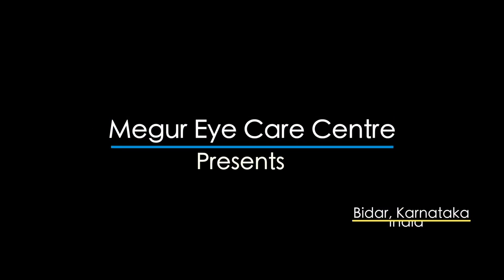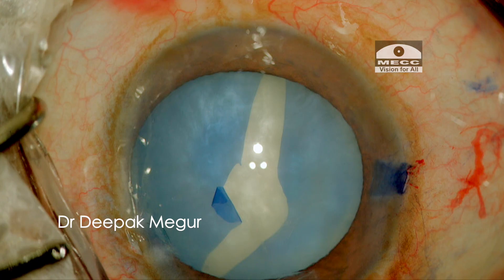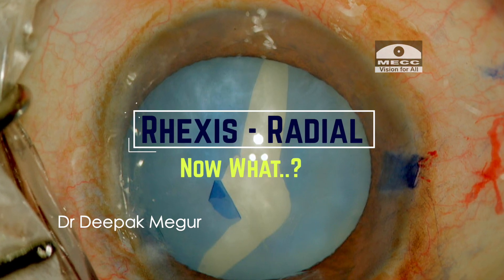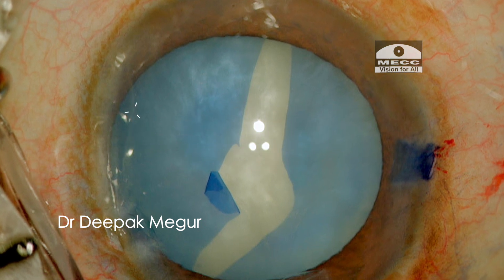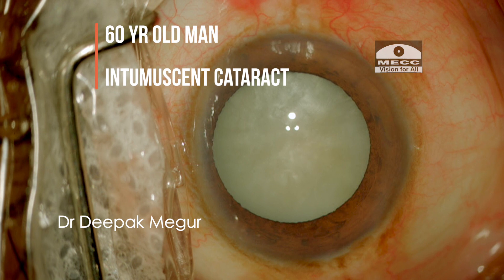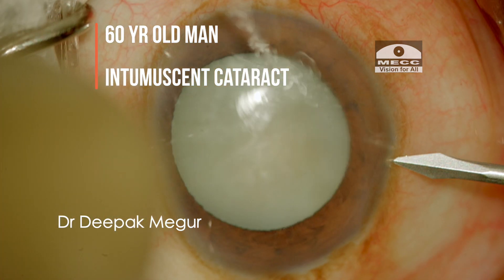Hello friends. I have an important video for you on how to go about in a case wherein we have had a capsulotomy extension to the equator in an intumescent cataract. This is an intumescent cataract with a tense anterior capsule in a 60-year-old male patient.